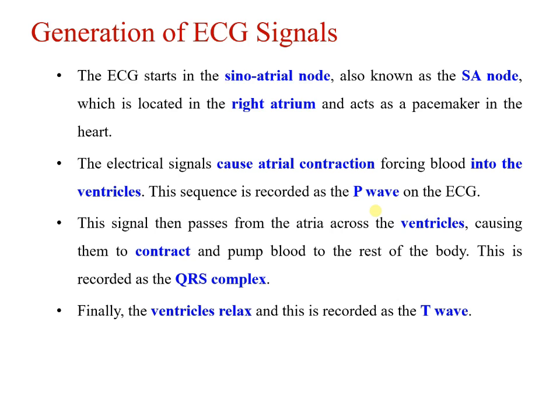This whole process is recorded as the QRS complex, and finally the ventricle relaxes and it is recorded as the T wave.